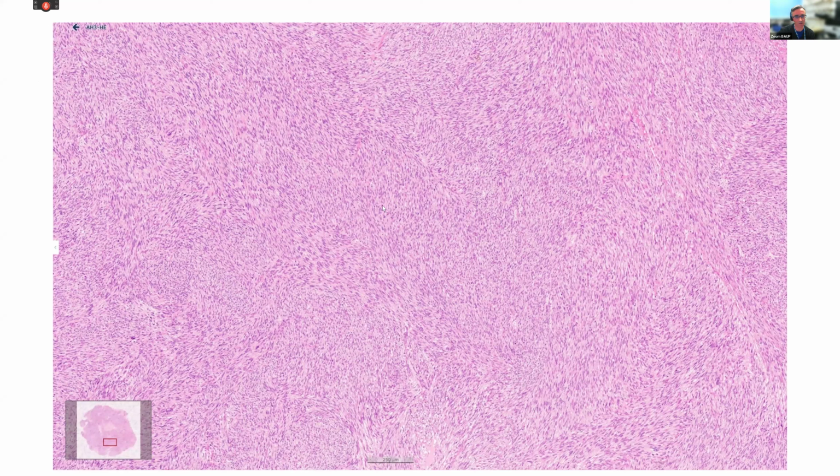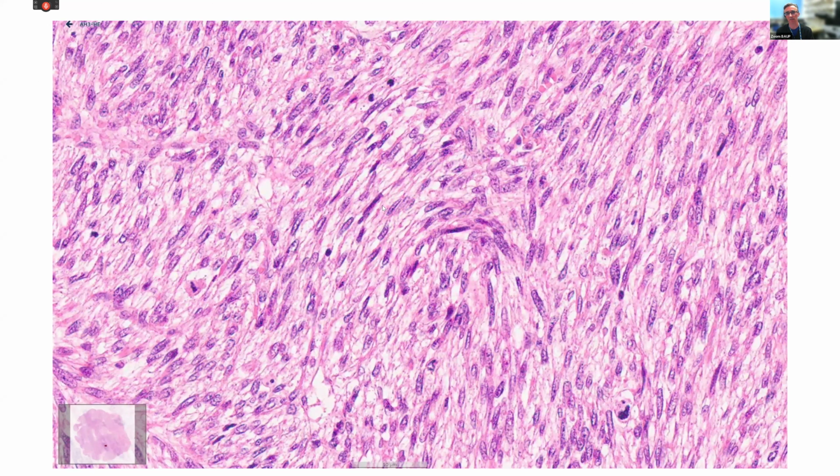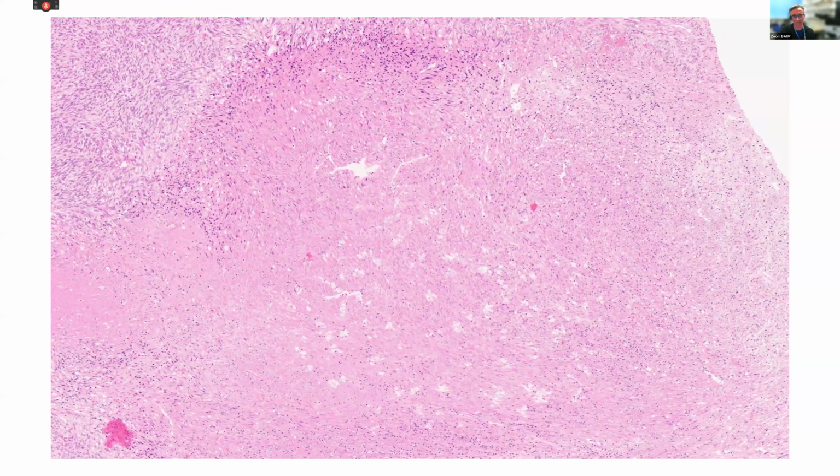And when we do zoom up, it was clearly a spindle cell population, varying degrees of pleomorphism, but mitosis very common, very easy to find mitotic figures. No evidence I could see of any epithelial component, as in any clear cell component or any glandular component. So this is just a shot then of the quite easy to find areas of necrosis.